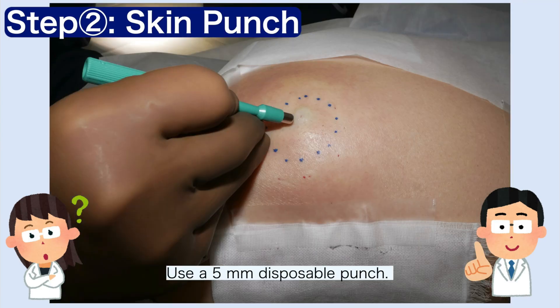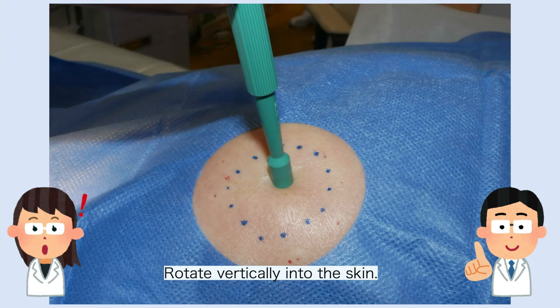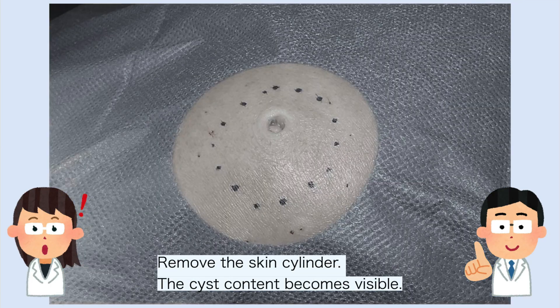Step 2. Use a 5-millimeter skin punch. Apply vertical pressure while rotating clockwise and counterclockwise until reaching the subcutaneous fat. Excise the cylindrical skin core. You will see the keratinous material and sebum of the cyst beneath.